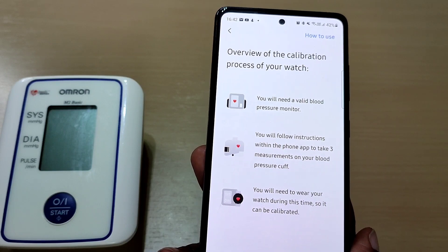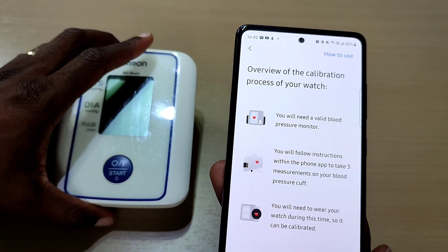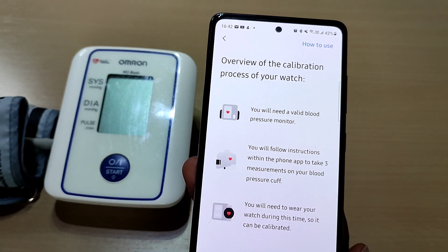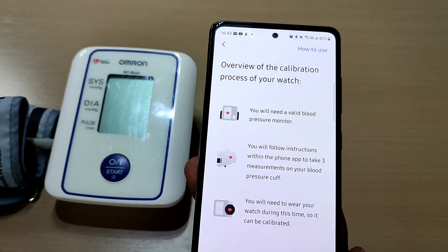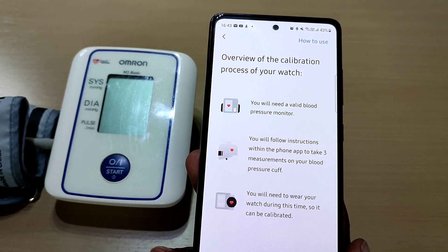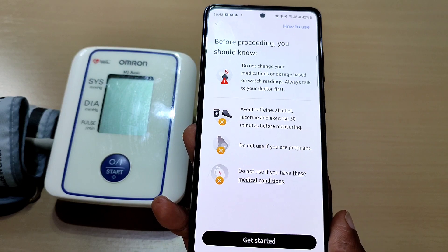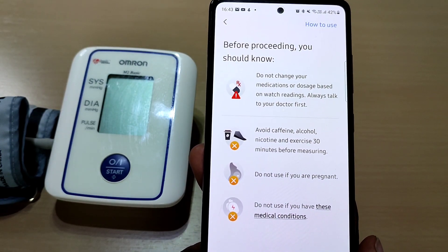Overview of the calibration process: you'll need a valid blood pressure monitor — we've got that here. You'll follow instructions within the phone app to take three measurements on your blood pressure cuff. It also says you need to wear your watch during this time so it can be calibrated. Press Next.